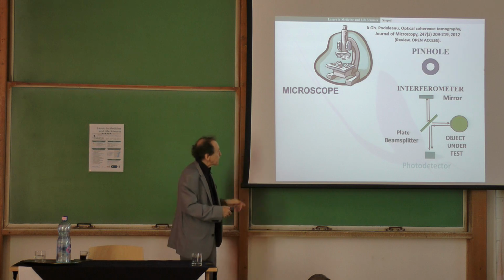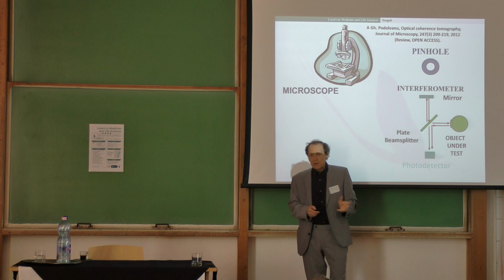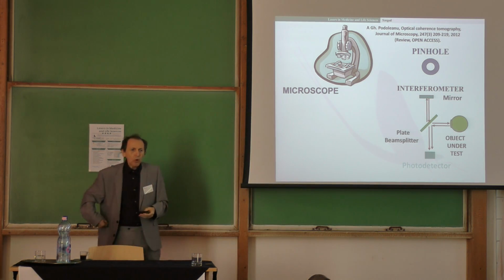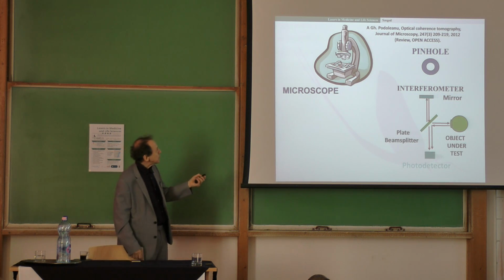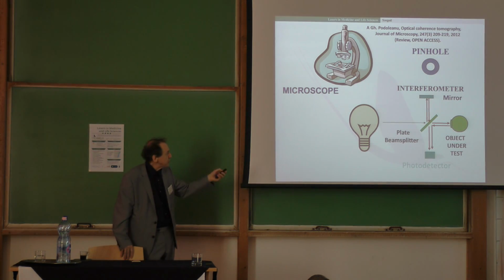Okay. What you also need is to place here a pinhole, like in confocal microscopy, to eliminate the off-axis rays. Okay. And you need a microscope frame and the broadband source. So all these were the ingredients of the time domain I have just finished. Fine. So that was the time domain.